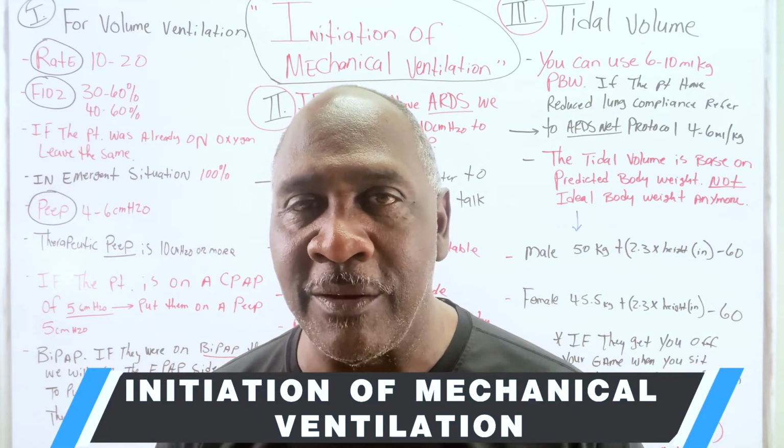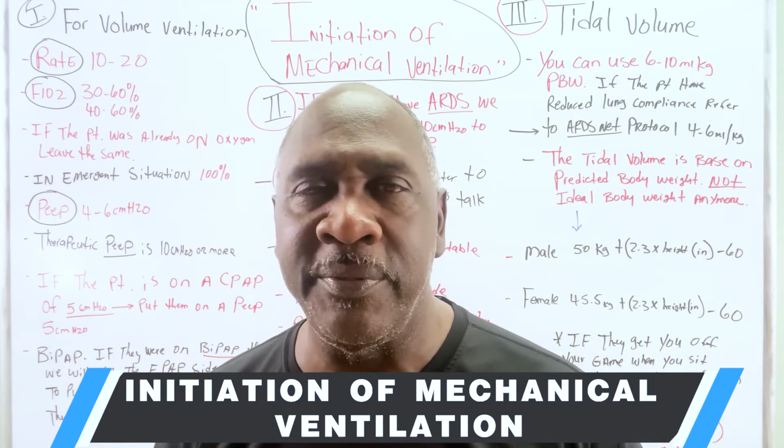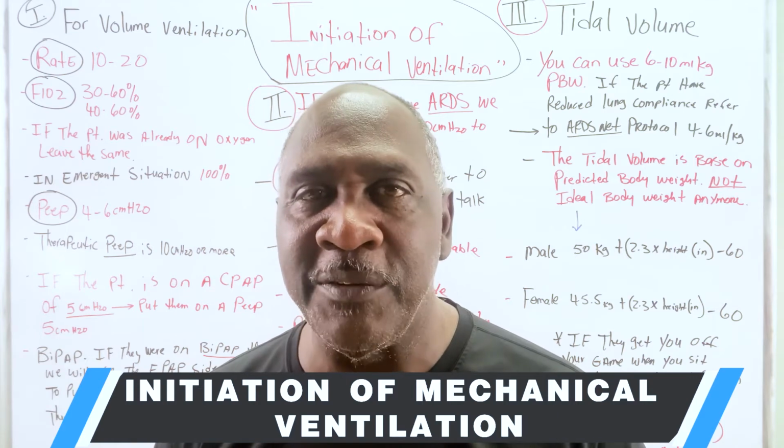Now, tonight we're talking about the initiation of mechanical ventilation, one of the bread and butter for a respiratory therapist.